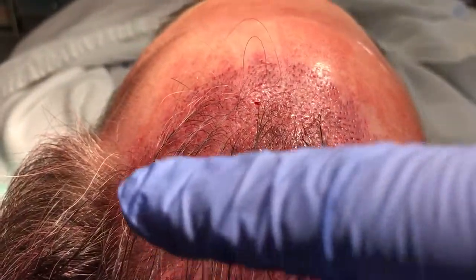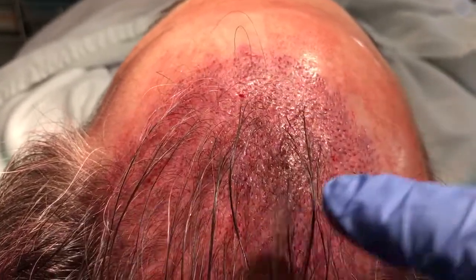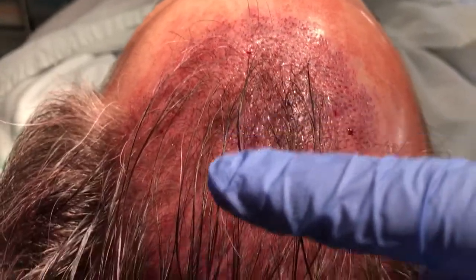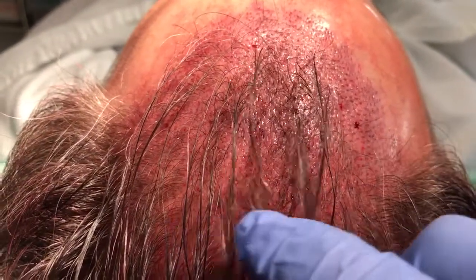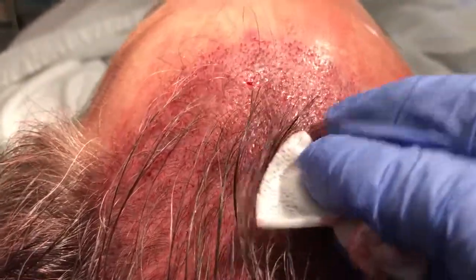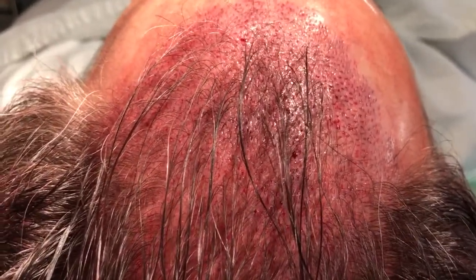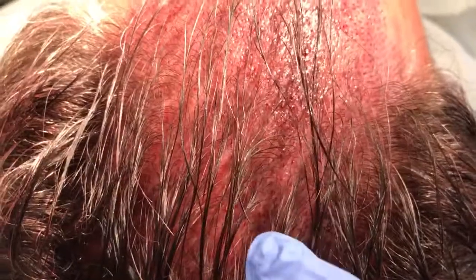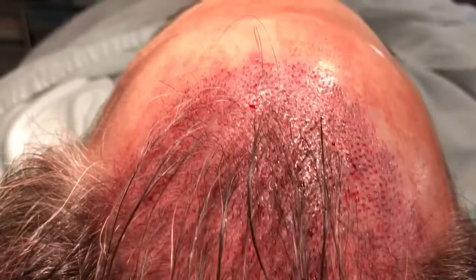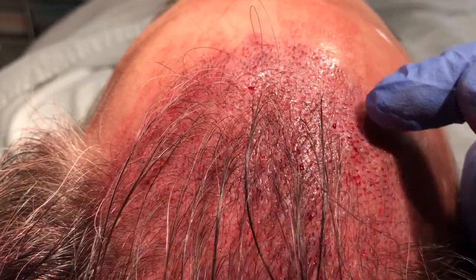No, priority one is to make sure this hairline is very dense. Priority two is to create the central forelock area as a second priority density zone. But then you need to gradually come down over here. So these graft sites are not as dense, but it's not as critical, because if I made the same density throughout from front to back, it's not the best use of the density. All the way to the back side over here, the grafts are again denser to help with the crown area.